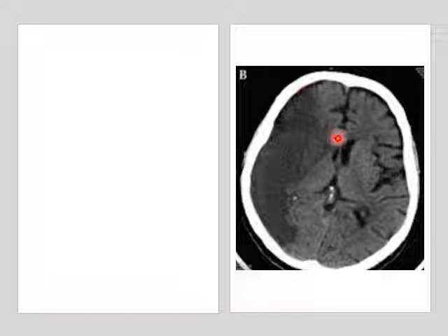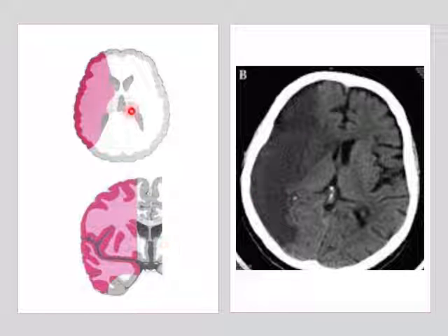It is a hypodense lesion of the right cerebral hemisphere. And this hypodense area is in the territory of the middle cerebral artery, which is occluded by thrombus or embolus, okay, causing infarction of this part of the brain.